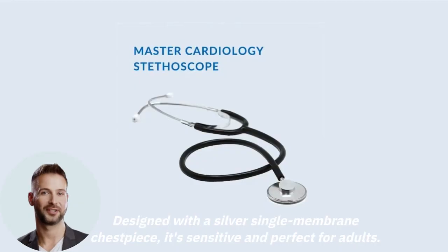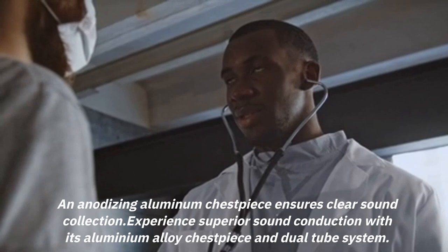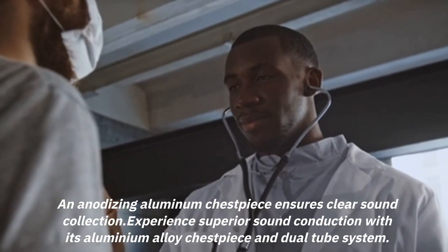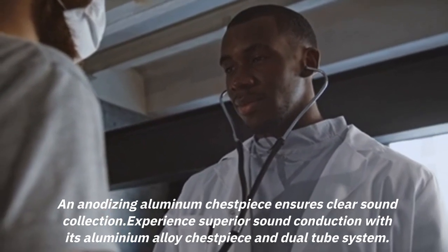Designed with a silver single-membrane chest piece, it's sensitive and perfect for adults. An anodizing aluminum chest piece ensures clear sound collection. Experience superior sound conduction with its aluminum alloy chest piece and dual tube system.